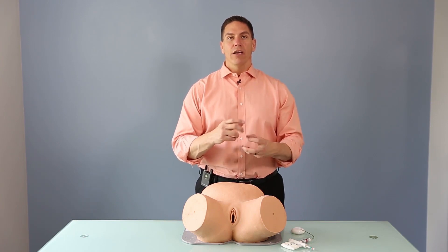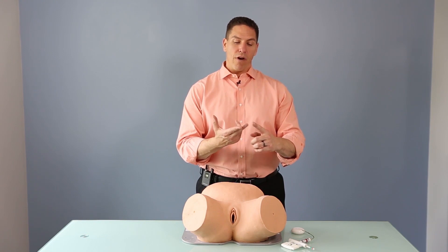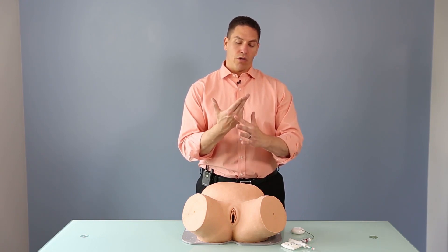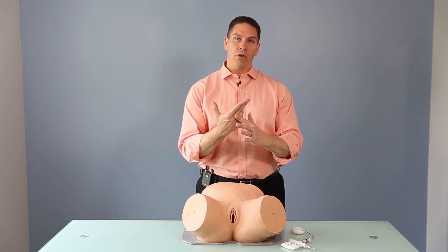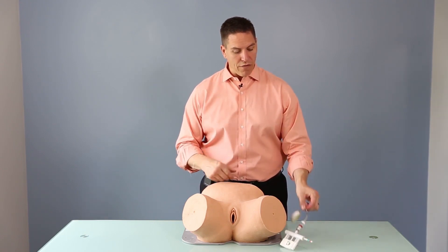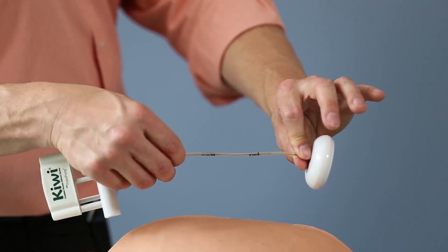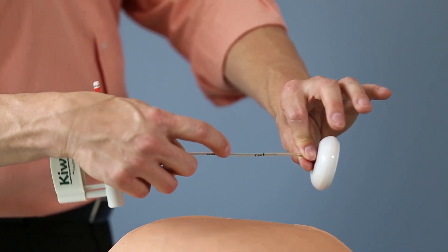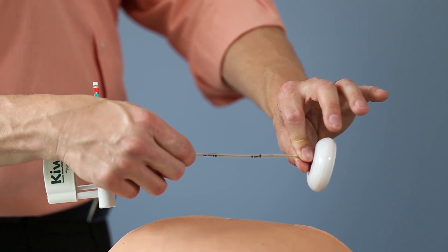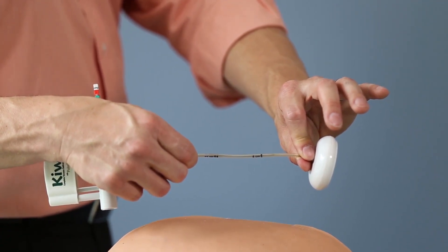During the vaginal exam we can determine the distance from the flexion point to the perineum, or where the posterior fourchette comes in contact with your hand. This references the marks found on the Kiwi Omnicup. On every Kiwi Omnicup there are marks on the stem at 6 and 11 centimeters, which are designed to coincide with the naturally occurring landmarks on your hand.